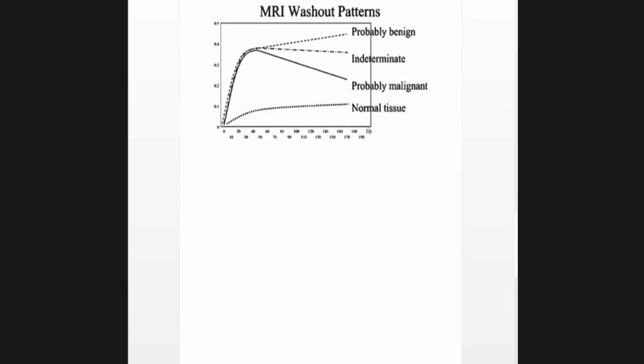But if we did the graphs of that patient with the left breast tumor, you would see a washout curve, so rapid washout. Occasionally in the smaller ductal cancers, we often see these plateau curves, which are indeterminate for malignancy. So you'd see rapid uptake, but then a plateau of the contrast uptake.